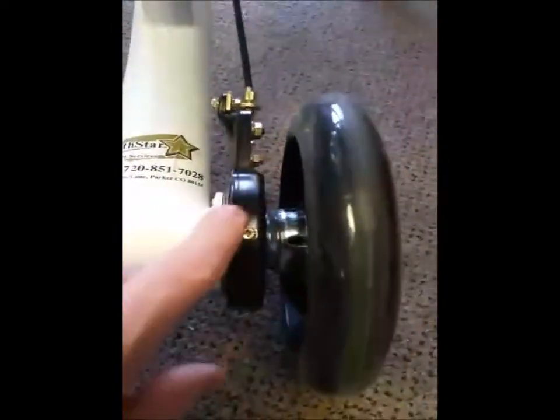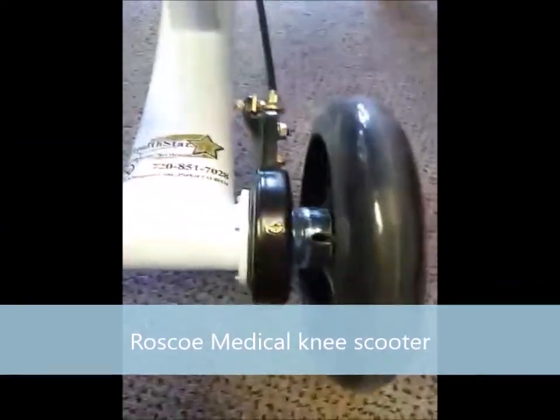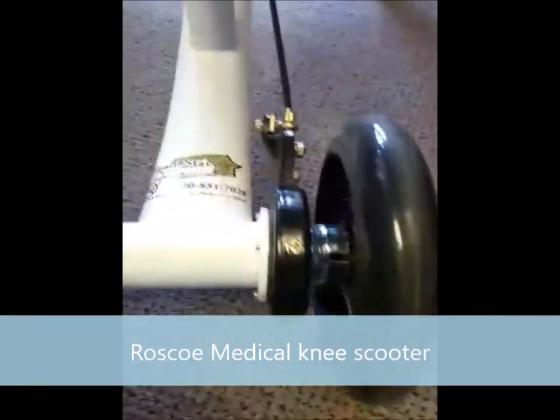The Roscoe knee scooters we use have disc brakes inside here, which are better than the ones that press against the wheel — because if the wheels get wet, those won't stop.